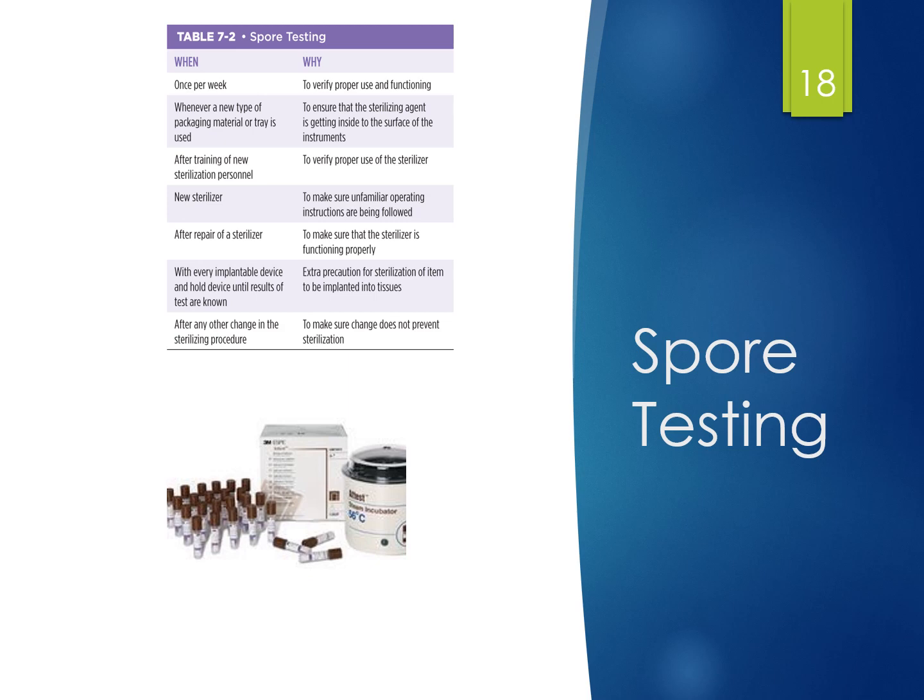Even though we have the bags that were shown earlier that give you that indicator, when it hasn't been sterilized, it's pink. When it has been run through the autoclave, it turns brown. But that doesn't tell if it's reached high enough temperatures to kill all pathogens. And that's what the weekly spore testing will indicate. And also those records are kept, done weekly, and they're kept in a log for any type of checks to make sure that it is working well.